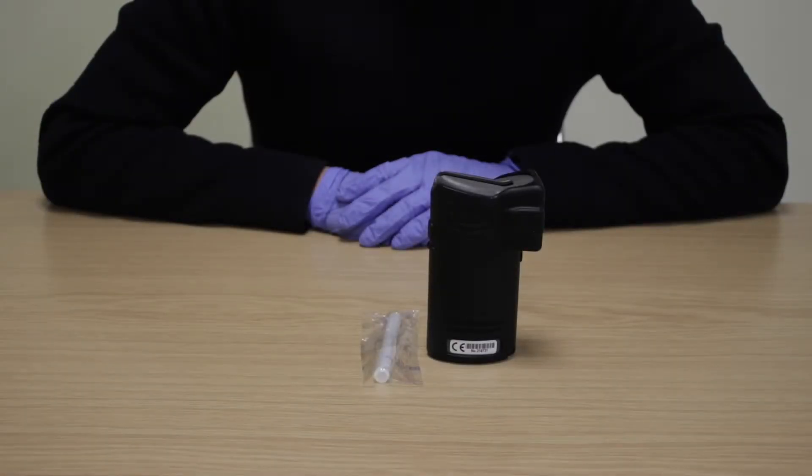Welcome to our product and user guide videos. Today we're going to demonstrate how easy it is to take a direct breath test on the Intoximeter AlkaSensor FST Breathalyser. The Intoximeter AlkaSensor FST is a UK Home Office approved device, used and trusted worldwide to provide accurate and reliable results.